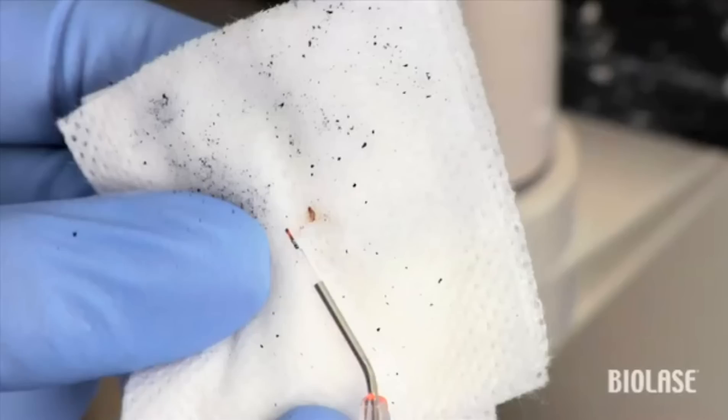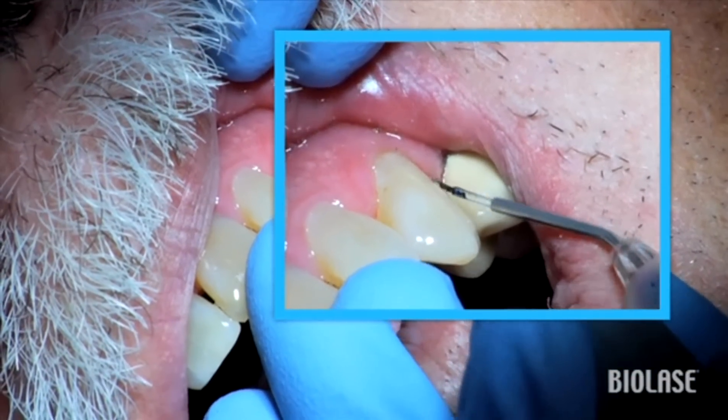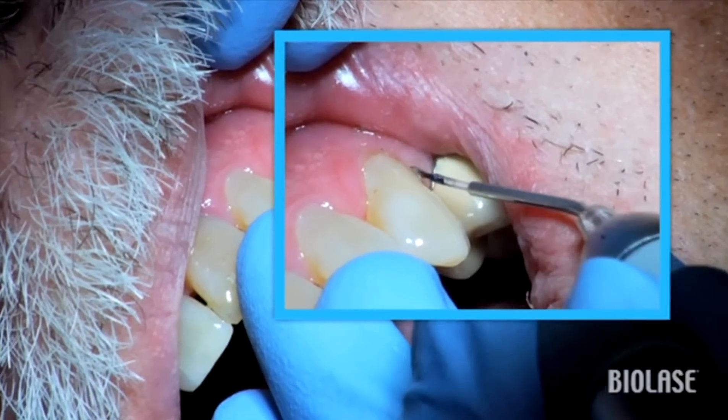To remove the tissue, gently wipe the fiber on a moist 2x2 and reinitiate the tip if necessary. In this view, you can see the zigzag technique again. Normally, one or two laser passes should be sufficient for good tissue removal.